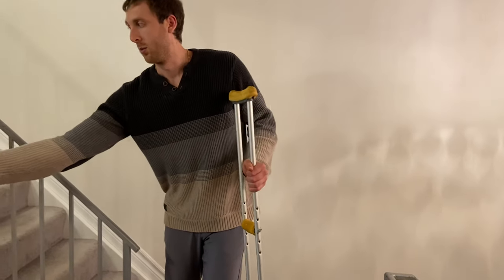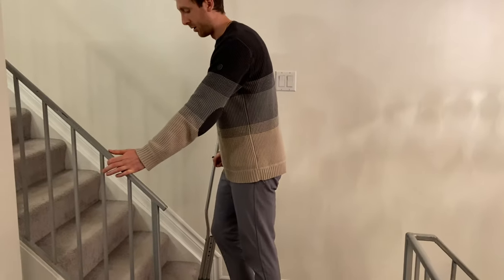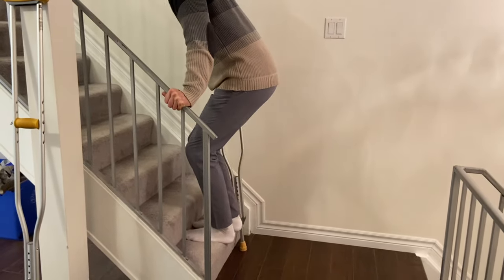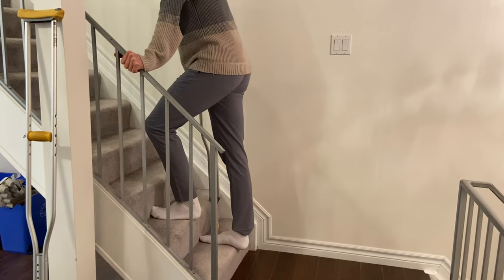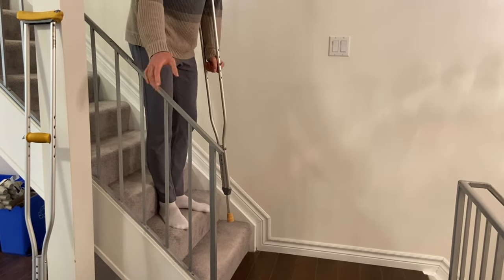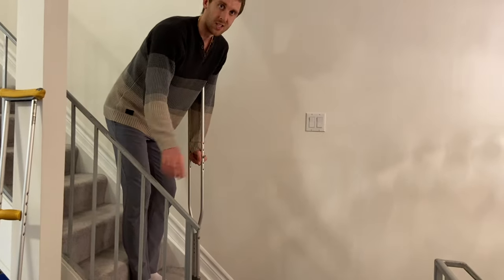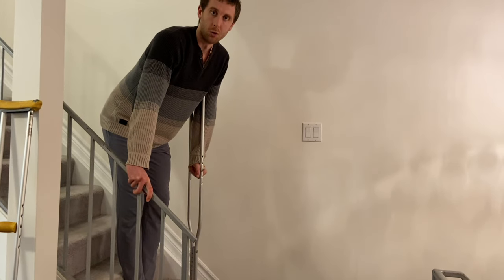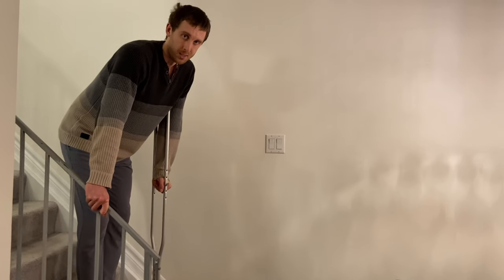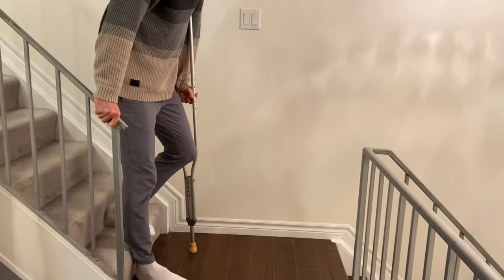With one crutch, it's a little bit easier. You'd have one crutch and one rail, but the same pattern applies. If you can put weight on the leg going up: strong leg leads, push down into the rail and into the crutch, crutch comes last. Going down the stairs: crutches down first, then sore leg, then good leg. The railing is usually more sturdy than crutches and easier to maneuver, especially for individuals who are more elderly or weaker, since crutches demand quite a bit of energy expenditure.